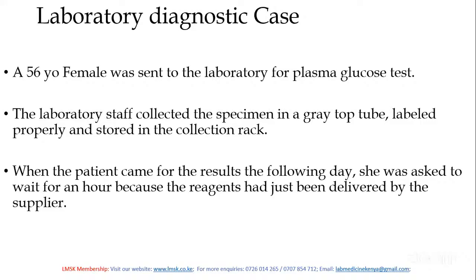Allow me to start with the laboratory diagnostic case. We have this case where a 56-year-old female was sent to the laboratory for plasma glucose tests. The laboratory staff collected the specimen in a gray top tube.